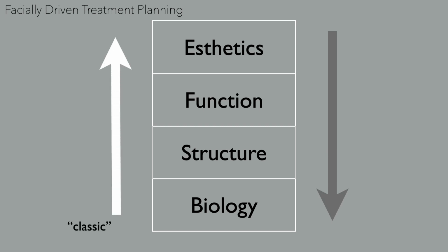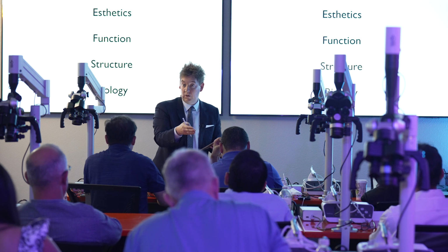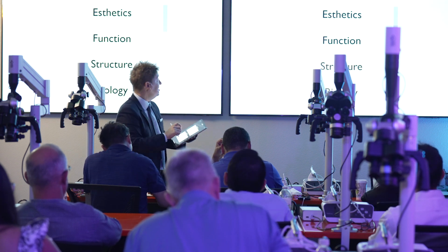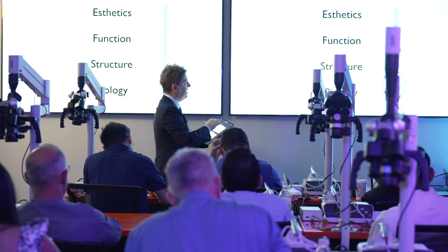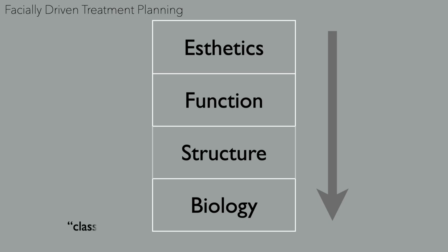And this whole concept is what we refer to as using the patient's face to develop tooth position, which always starts with aesthetics, which is the exact opposite way that you were taught to treatment plan in dental school. All right? So facially deriving the plan, working from the top to the bottom, when you and I in school were taught to work from the bottom to the top.